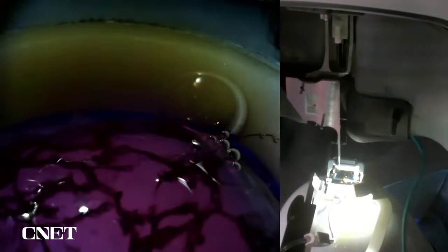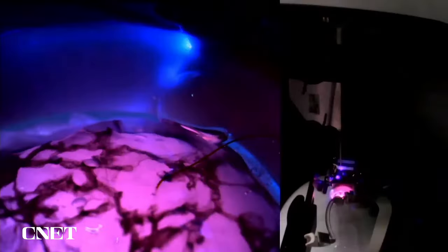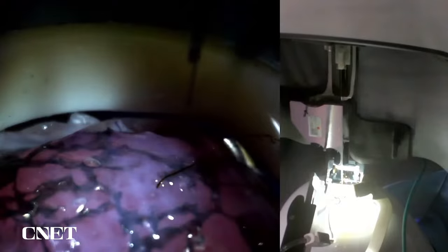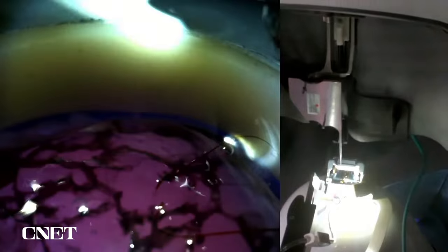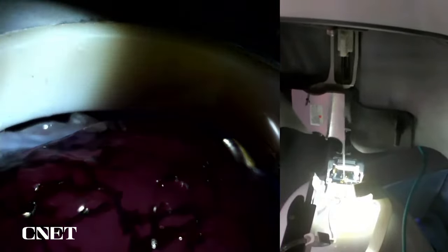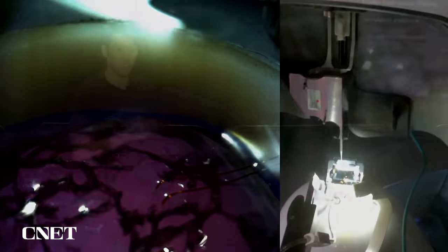There you go — that's the first insertion. We're going to see a couple more. The whole process of inserting about 64 threads in our first product is going to be around 15 minutes for this robot. There's a second one that went in, and we're going to do a third one — there you go. That's going to run in the background and we'll come back to it in the later part of the presentation.